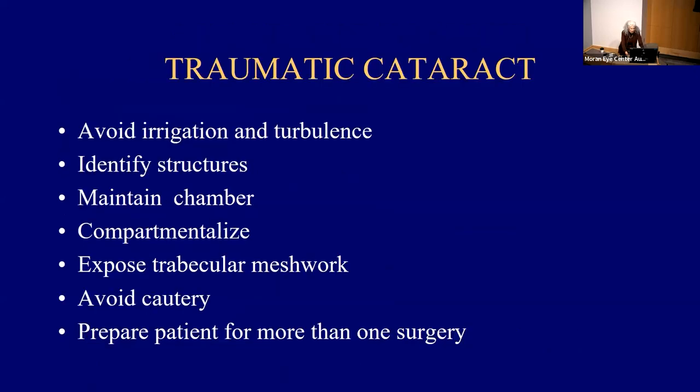And just to sum up: avoid irrigation and turbulence, identify structures, maintain the chamber, compartmentalize, expose trabecular meshwork, avoid cautery, prepare the patient for more than one surgery.